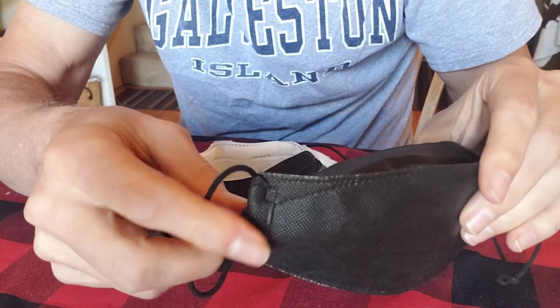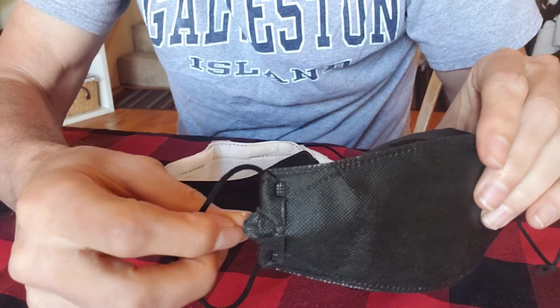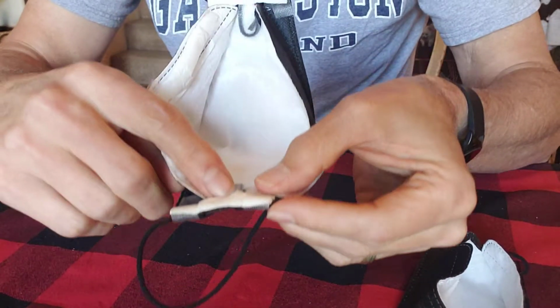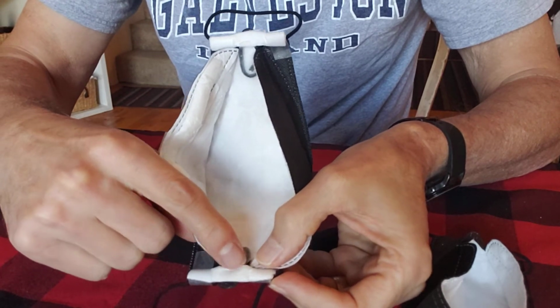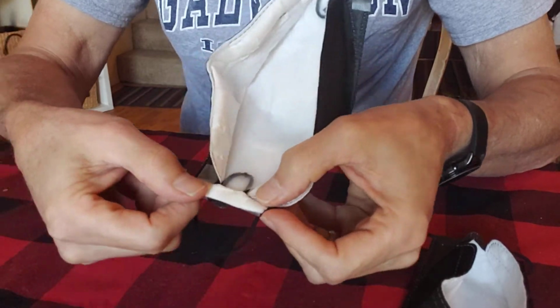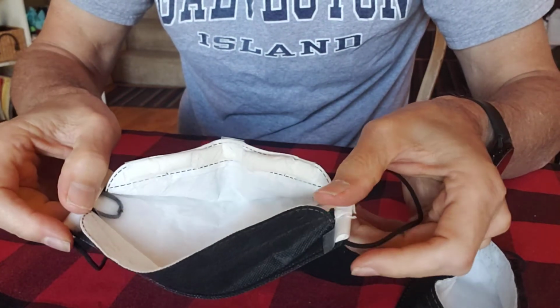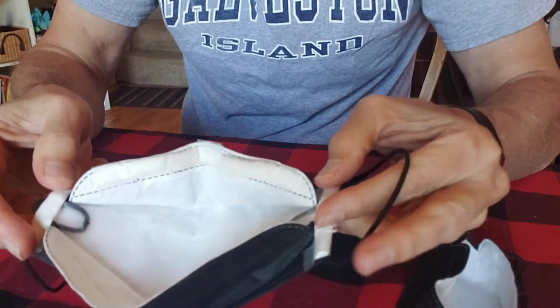And the way to get around that is, rather than to let it loose, I pull out that loop and I fold it around in here, tape it down here, and then having that loop running through there does create a little bit of a rough surface which would leak, but then once you put the toilet paper back over it, it doesn't leak. So, you know, whether or not you need toilet paper on the sides is up to you. Other people may find it useful.